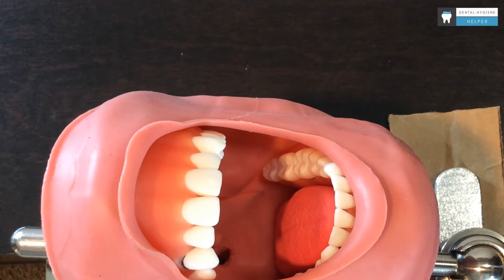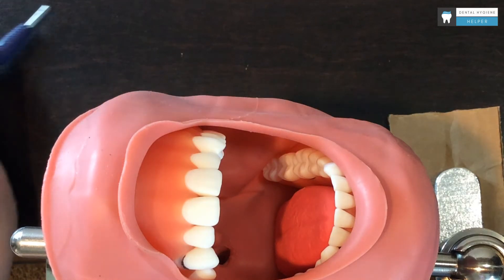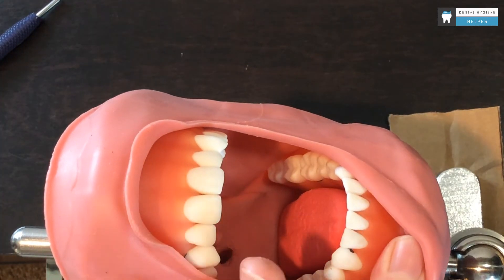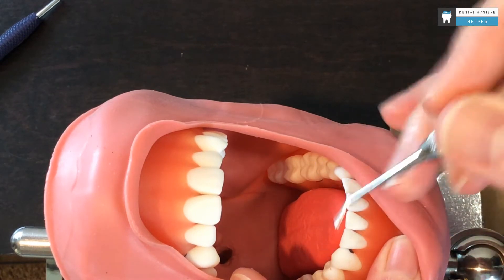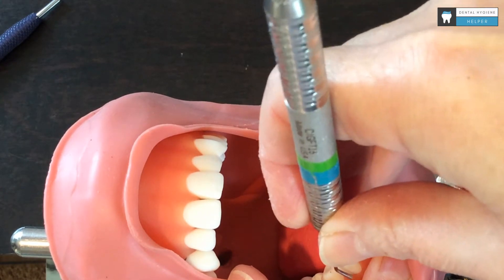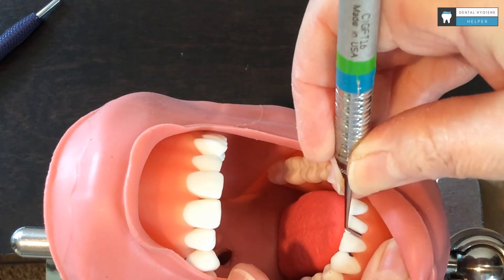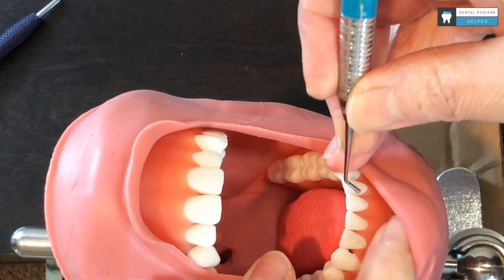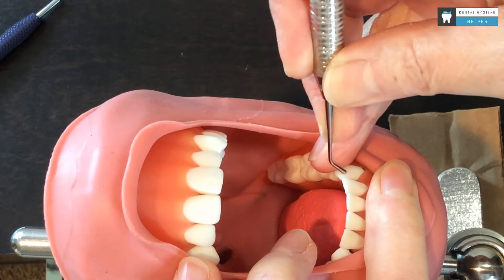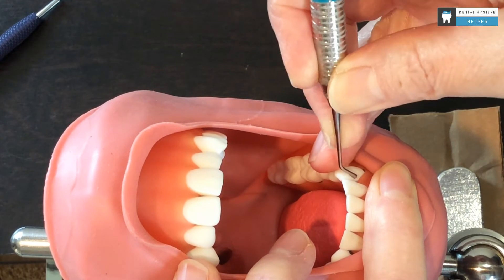I'm going to start with the anteriors with the surfaces toward me. I am at the 9 o'clock position. I do not need my mirror for this, so I am going to retract with my finger. I can get up on my fulcrum on the incisal edge here, working on all the surfaces towards me. As I move to this last canine, I am up on the buccal cusp tip of number 21.